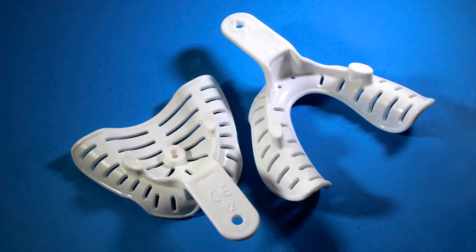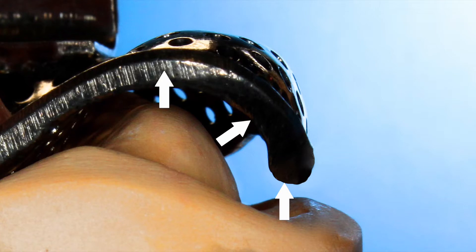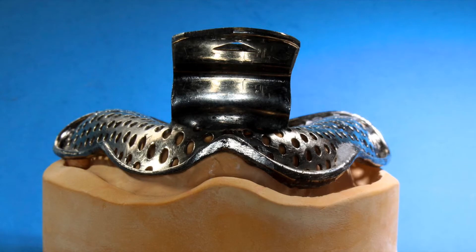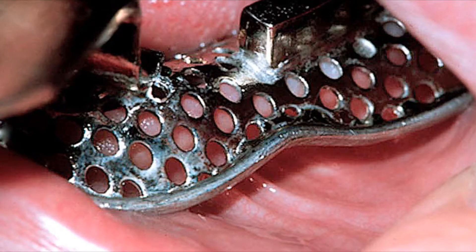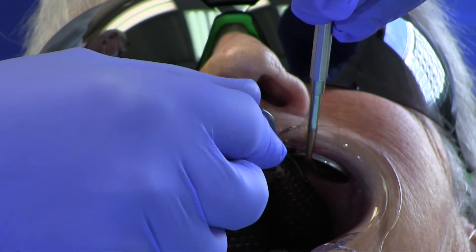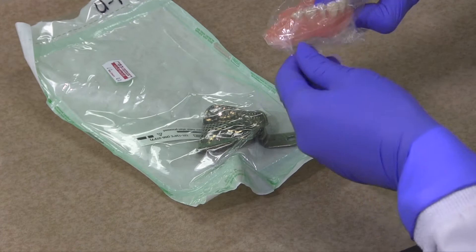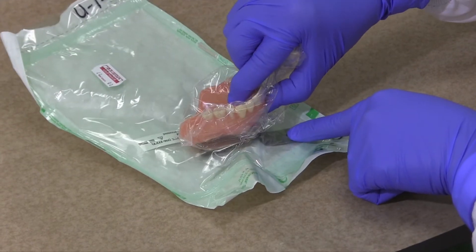Use metal or plastic edentulous trays that provide 5-7mm of space from the tissues. This will help to improve strength and minimize distortion. The space also provides room to capture the frenum and vestibular roll without distention. If a stock tray is too large, it will distort and distend tissue, which can have adverse effects on the fit and comfort of dentures. Selecting a proper size tray is a critical step for preliminary impressions.